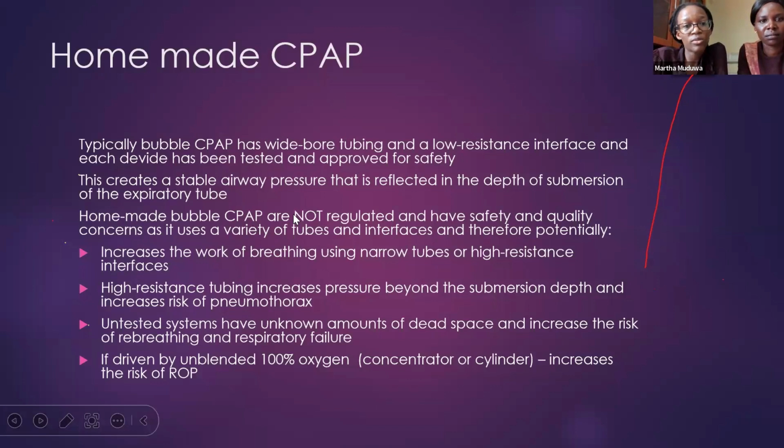However, the challenge with our homemade CPAPs is, and also we mentioned a lot of the need for continuous monitoring and the need for blending of oxygen. So when we look at most of the homemade CPAPs that are used in our settings, you find that you're not certain of the depth of submersion. You cannot measure the pressure that you're giving.